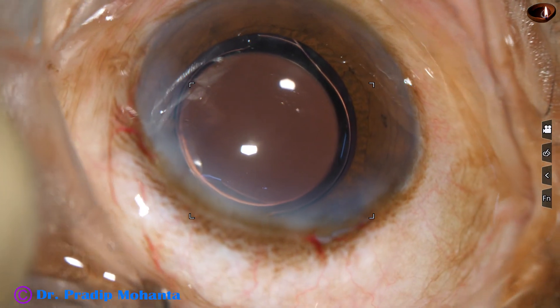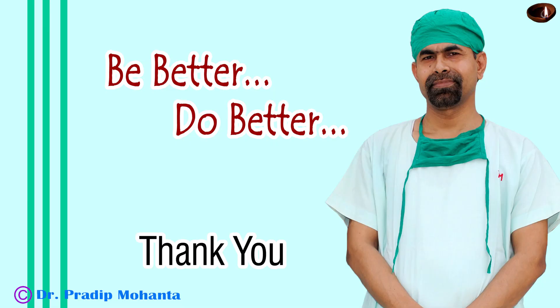Thank you very much for your attention. Hope this video will help you in developing your surgical skills. Be a great surgeon — be a master of submarine chop. This is a very nice technique for hard cataracts like grade 3, grade 4, grade 5, even grade 6.